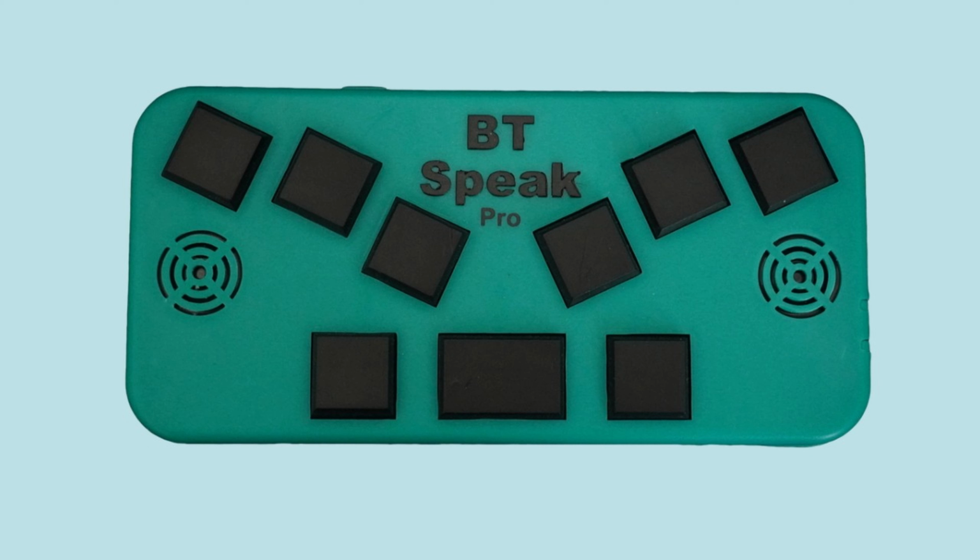The opposite is dot 1 chord. So if I press that, that goes to the previous line. Two things were certain every Saturday. Growing up, pancakes blank. If I press, let me move back to that line. Two things were certain every Saturday. Okay, if I want to reread the line, I press both keys, dots 1 and 4 with the space bar. Two things were certain every Saturday.